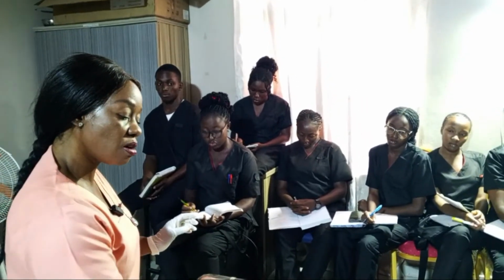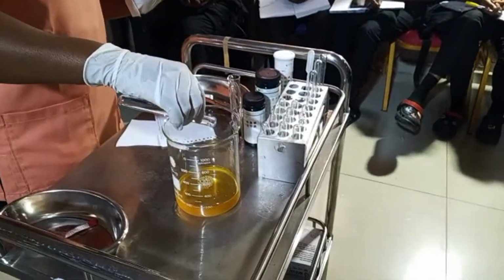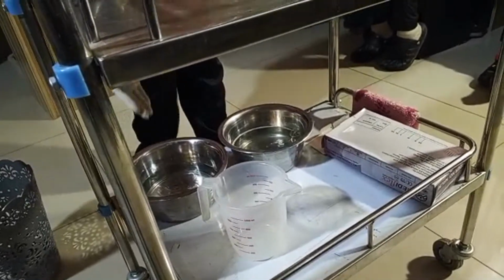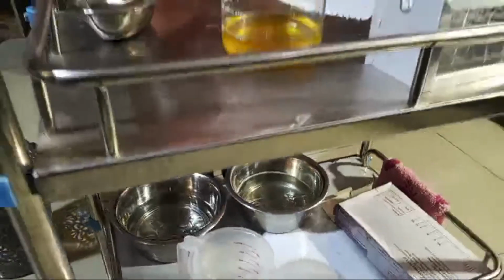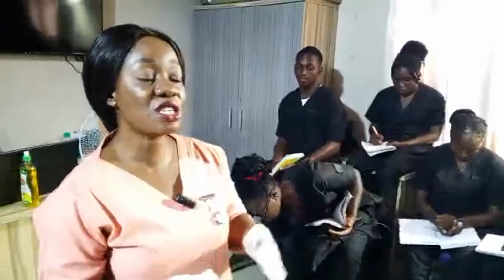You can also turn the urine back, put it inside. I have soapy water and clean water, so I can rinse it here and then wash it with soapy water. Then the next step is for me to rinse with clean water, right? So the next thing now is for me to check the specific gravity of this urine, right? Remember, we have done the pH already because we are using Combi 9, isn't it? So you also note what you have gotten.